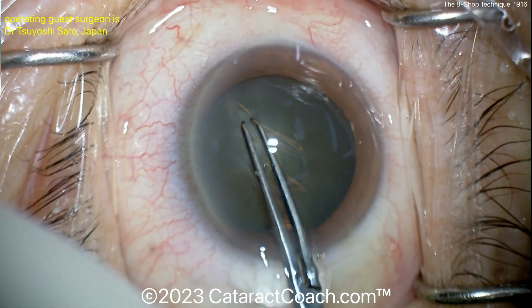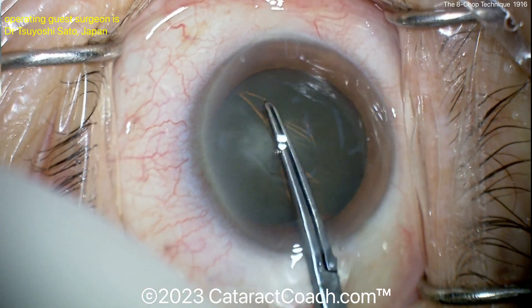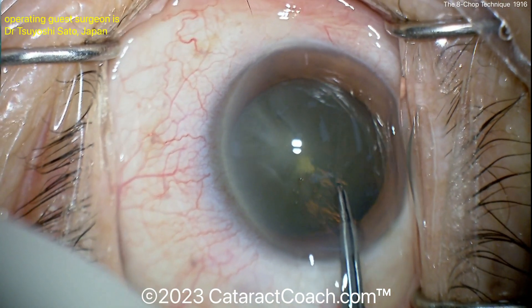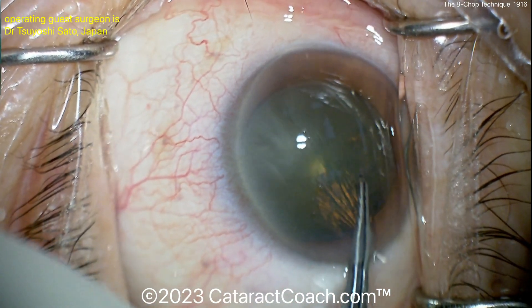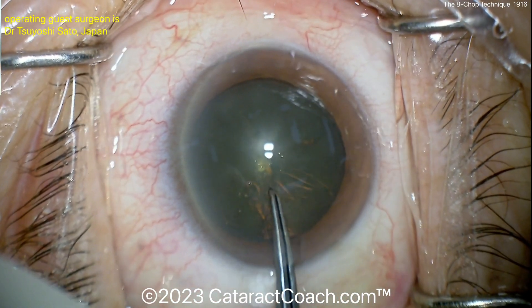Here comes the rhexis. Not sure how big this rhexis is going to be — it's pretty generous. We'll find out at the end; could be a smaller eye or hyperopic eye. And there's the rhexis being completed.